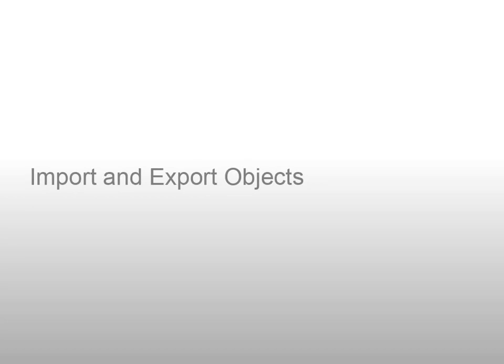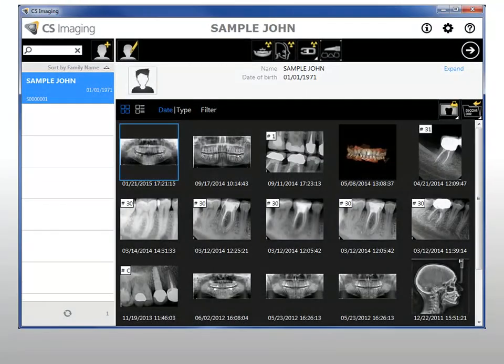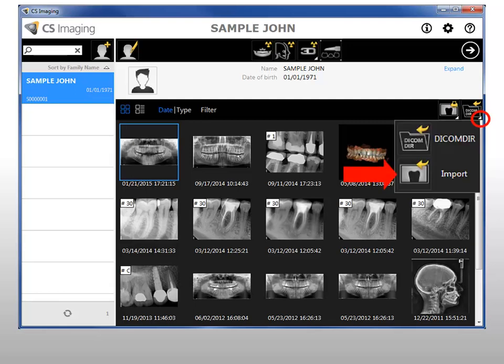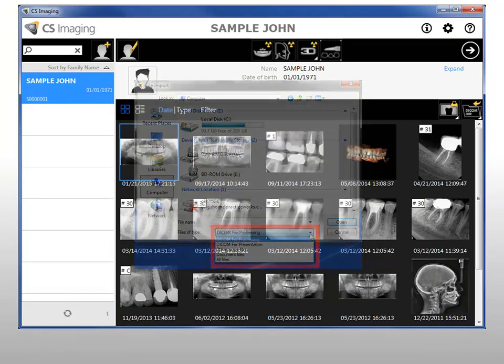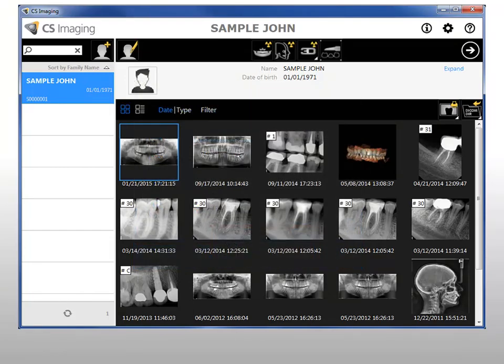Import and Export Objects. To import an image or file, in the Image Management Tools, click Import. The File Import dialog box is displayed. Select the image you want to import and click OK. Make sure you select the correct file type for the file you want to import. The selected file is imported into the selected patient card and is displayed in Patient History.